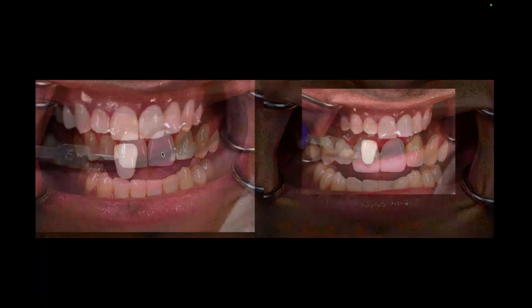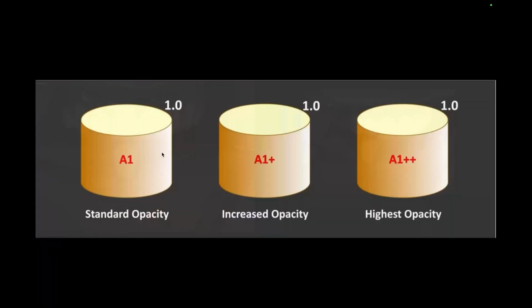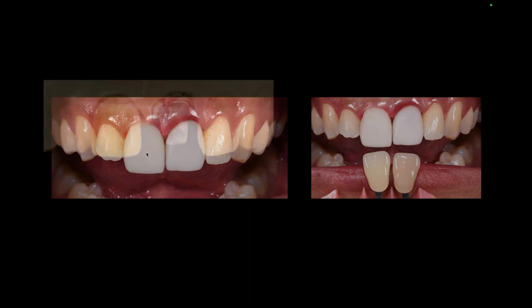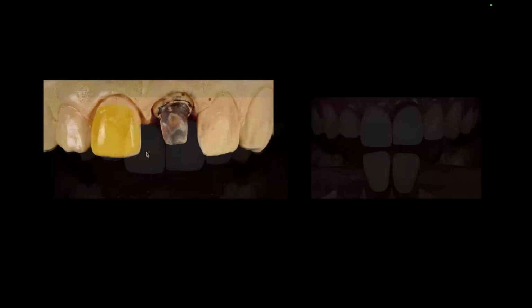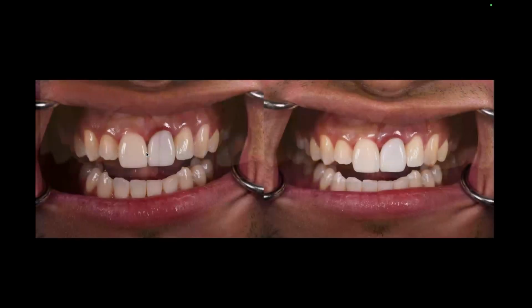Also, something interesting, I'm going to go back a slide for a second. Before the glaze paste was in, look at how white and bright that looks, right? That's the veneer part of it. Now, as I go forward, notice how that changes when you put that in the mouth and it starts taking on some of the coloration underneath it.